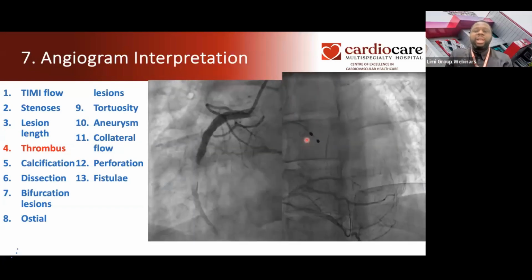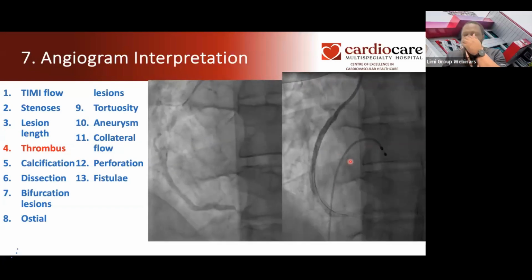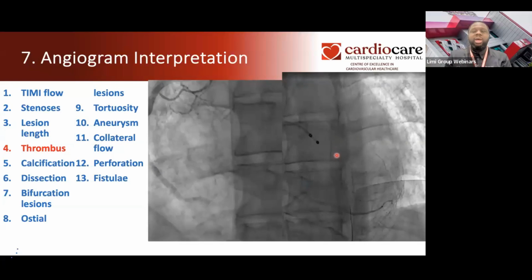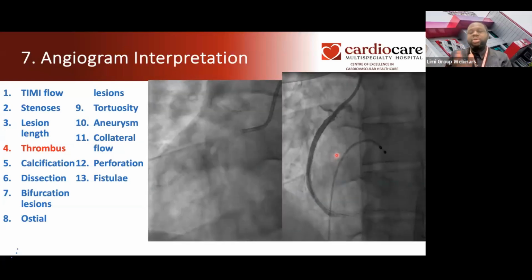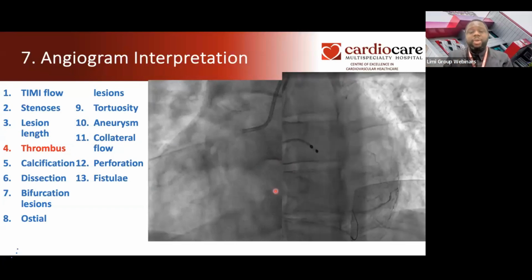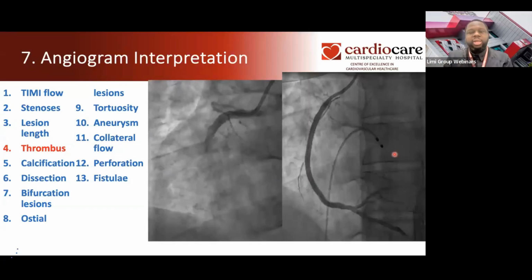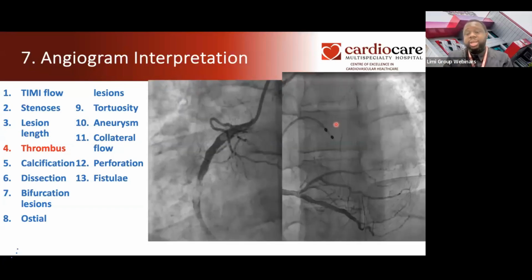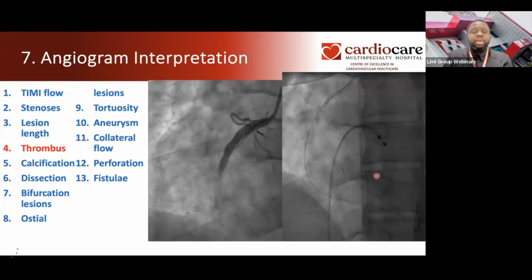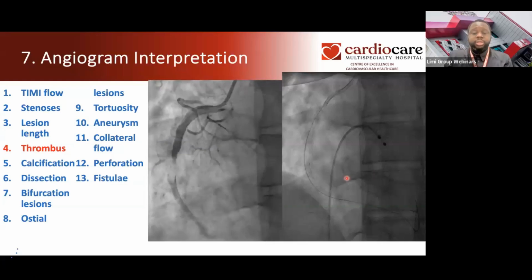So sometimes you put this as a precaution, or if the patient is already bradycardic, you put this temporary pacemaker. That makes sure that the heart is beating throughout the time you're working there. We pass it through the femoral vein, enter the right atrium, enter the right ventricle, and just leave it there. Connect it and then put it on. And it helps to provide that.